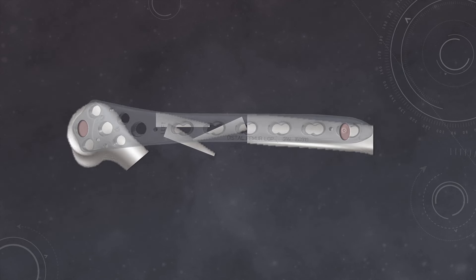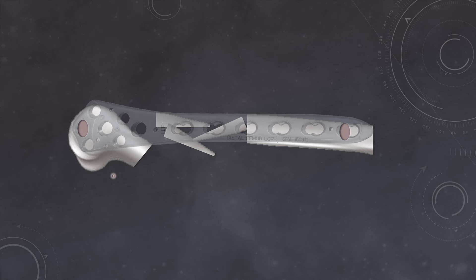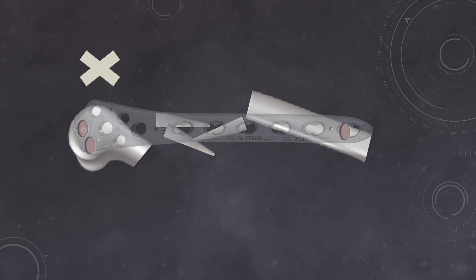Once we have secured the drill bit in both parts, the fracture can still angulate. But since we have placed only one drill bit in each part, we can still correct the reduction in the lateral view. This drill bit is acting as a center of rotation and we are correcting our reduction with the axis over it. We can also correct the angulation of the proximal fragment in the lateral view. But if we have placed multiple K-wires or drill bits, we will not be able to correct this angulation, because two wires will prevent any toggling of this fragment in relation to the plate. So always place only one drill bit proximally and distally once you are sure that the length of the fracture site has been properly restored.